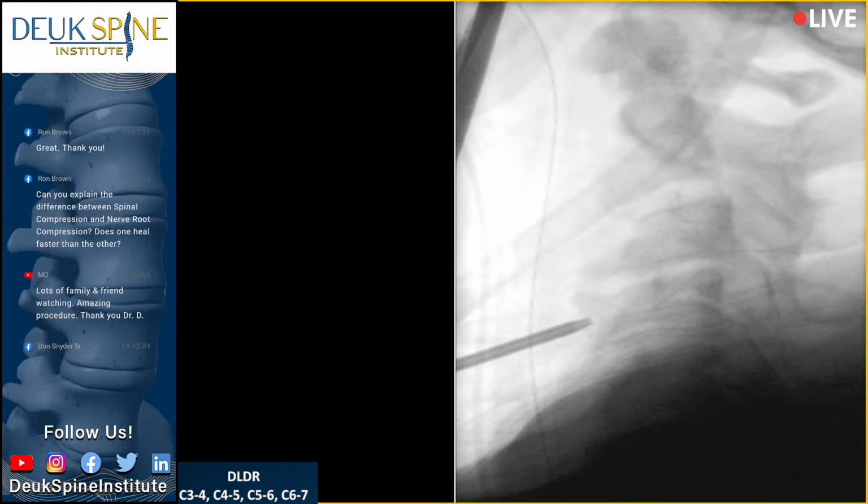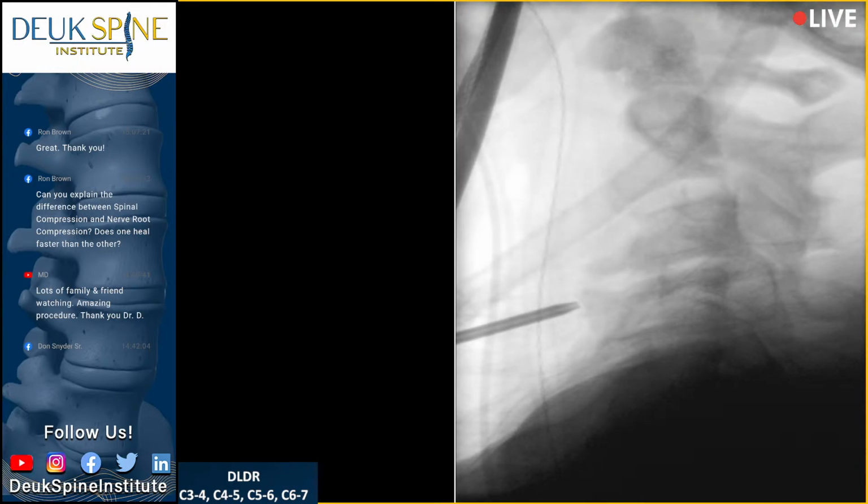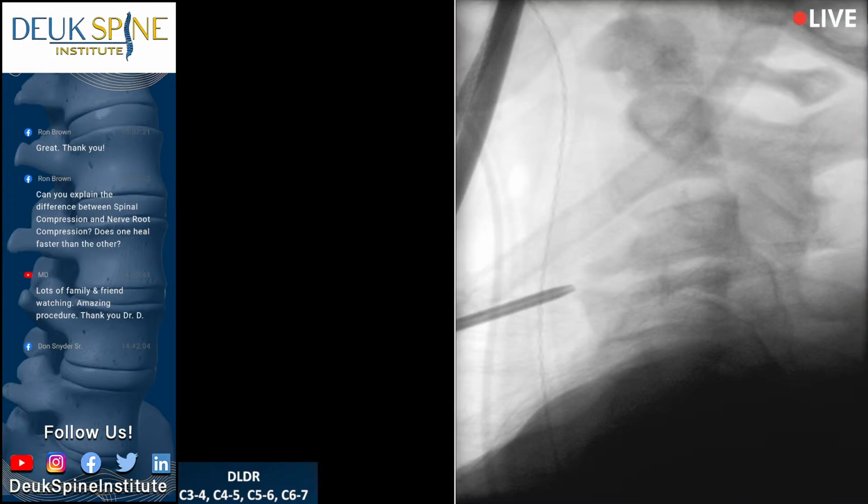Yep. So we got Mount Vesuvius to climb. Here we go. All right, so it's got a massive bone spur there. Shot? Shot? Shot? Shot? Oh, that is big. Shot? Give me an AP.